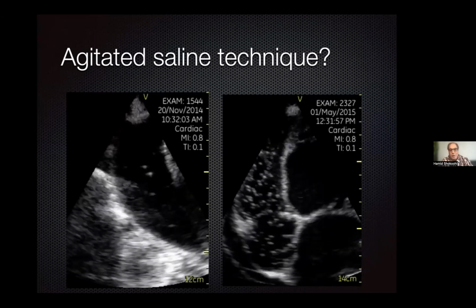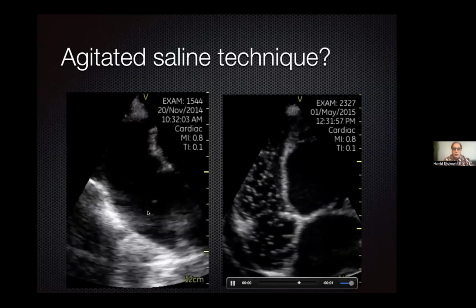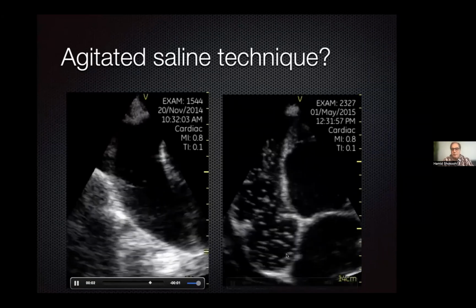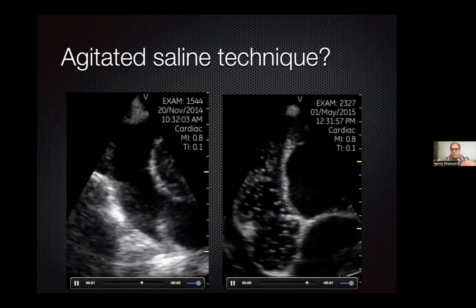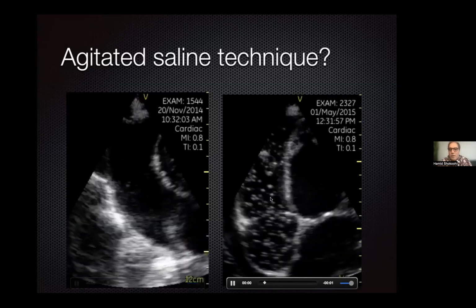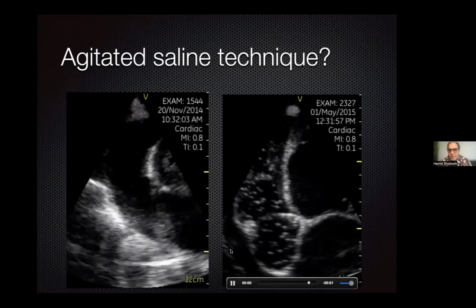And that pericardium, you can see that agitation inside. If you do a little bit more, you know this is not in the right place. We use that agitation. Agitation is nothing else, it's just the movement of the flow in the normal saline. We use that to confirm the patient has a central line in place.